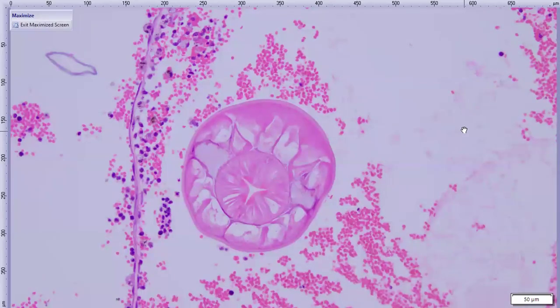It's big. It's not a larva, let's put it that way, which would be the early migrating larva. That's what you usually see, like the little Toxocara guys. Yeah, it's a big one floating in the chamber like that, which is another weird presentation. Kind of a strange one, but yeah, a satisfying finding at least.